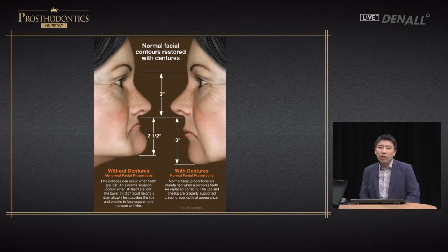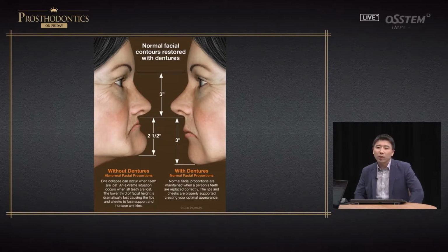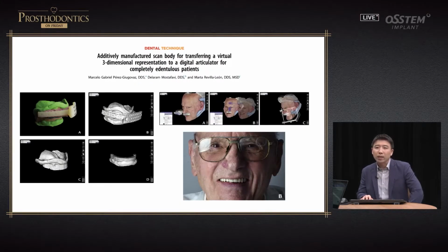I believe facial scanners can be of significant help for edentulous patients. As mentioned, lip support is what is exposed to other people in terms of patient's perspective every single day. And therefore, you can use facial scans a lot. Such attempts can be observed overseas as well. It's almost similar to the attempts that I'm making.